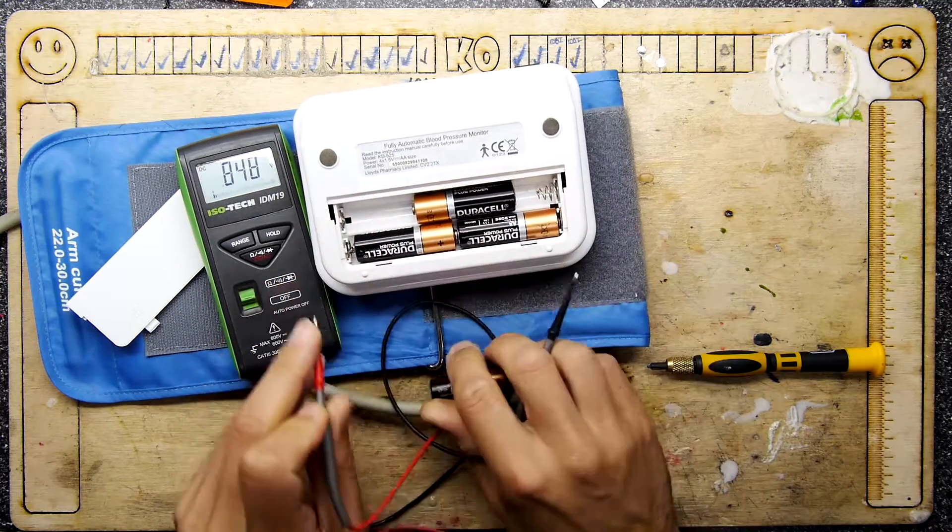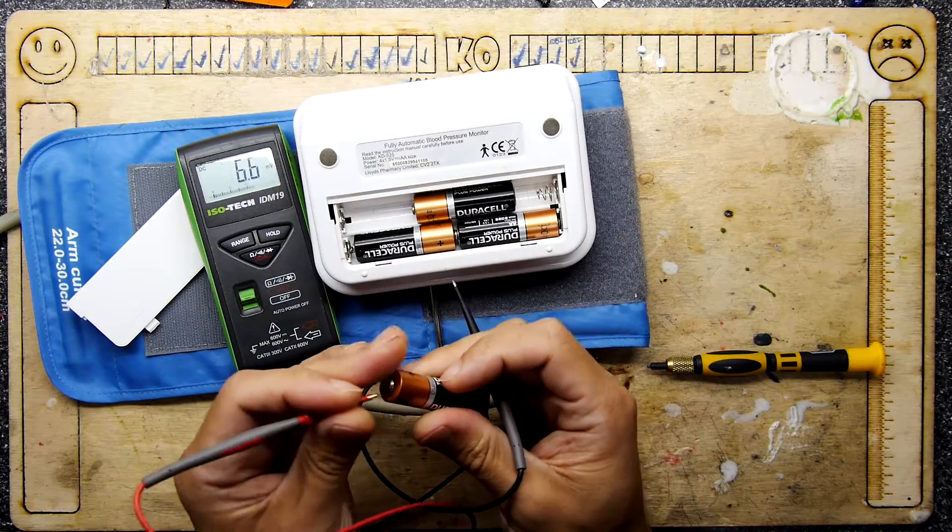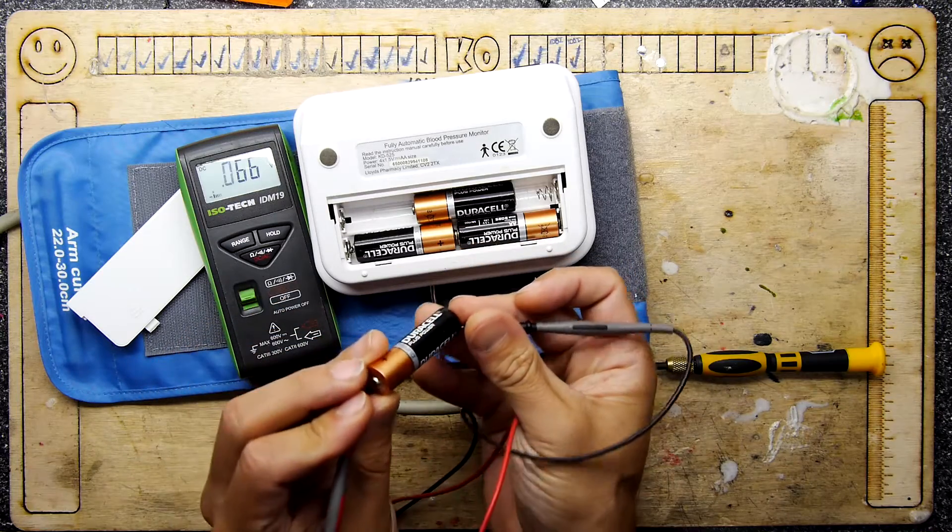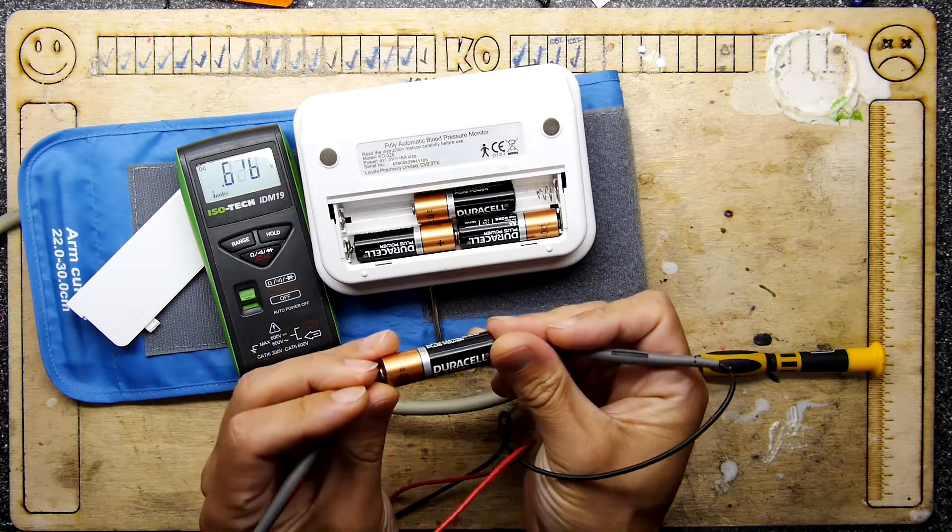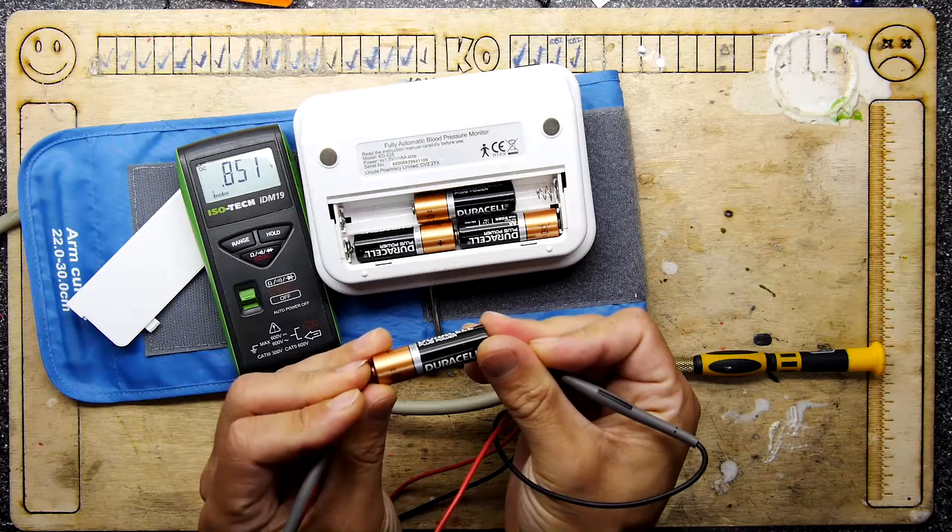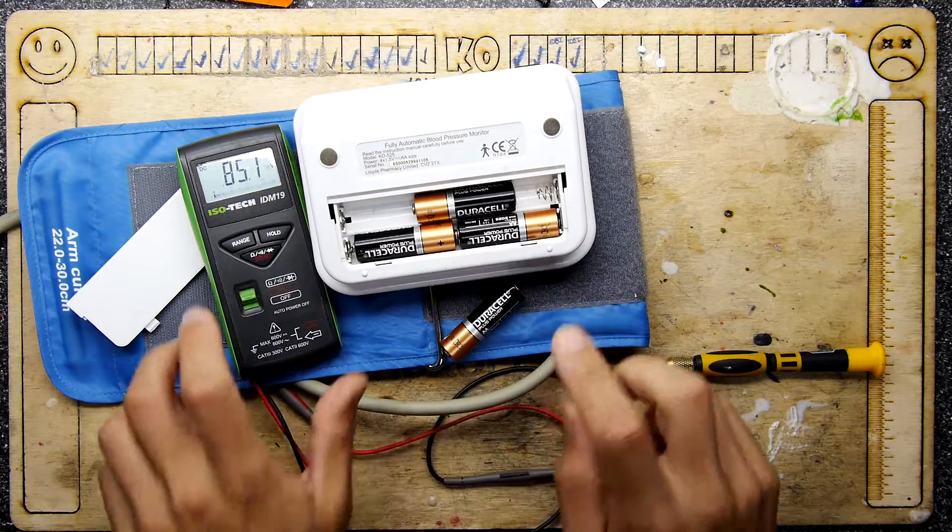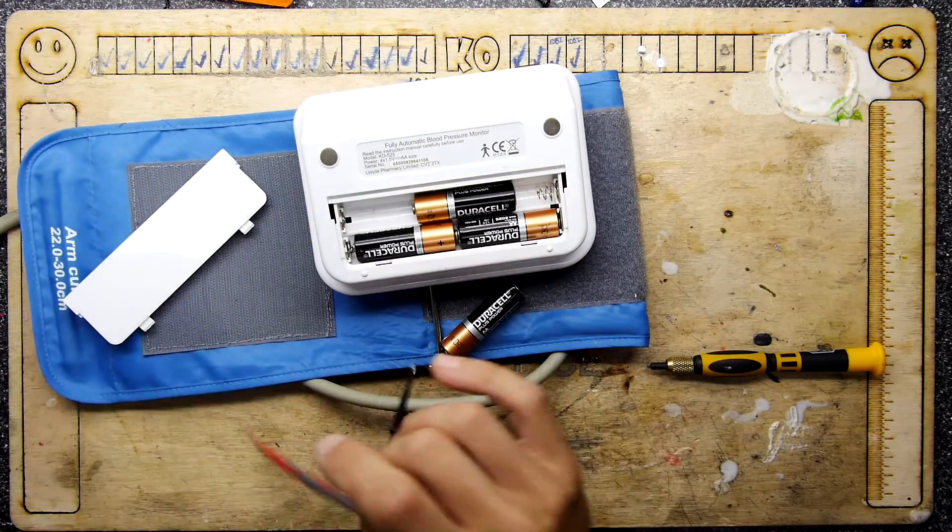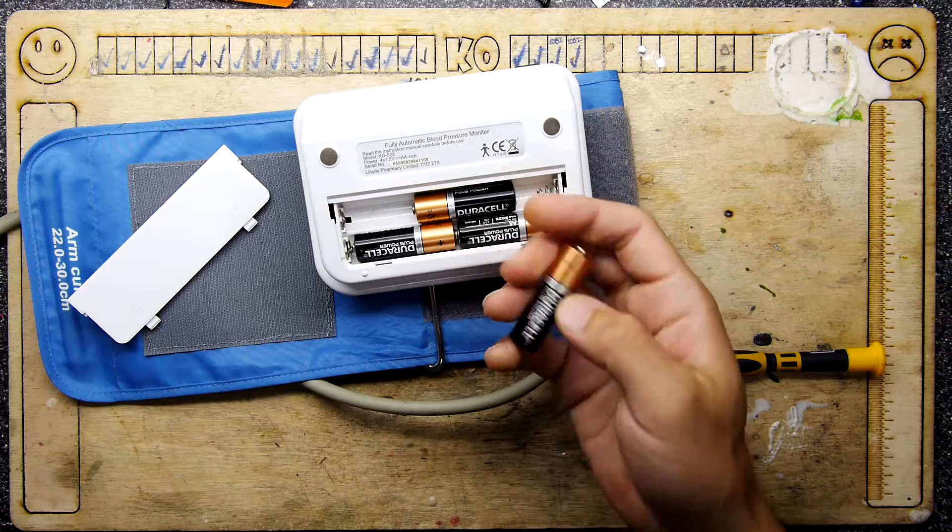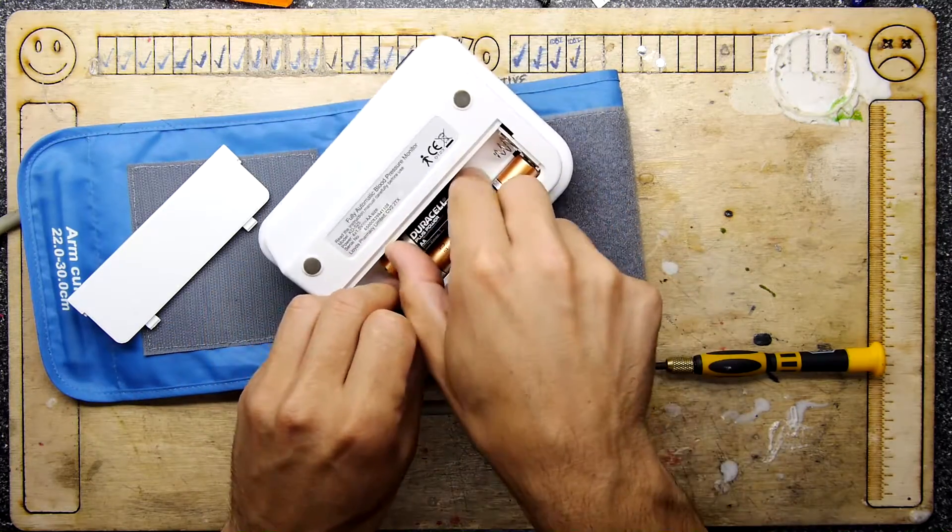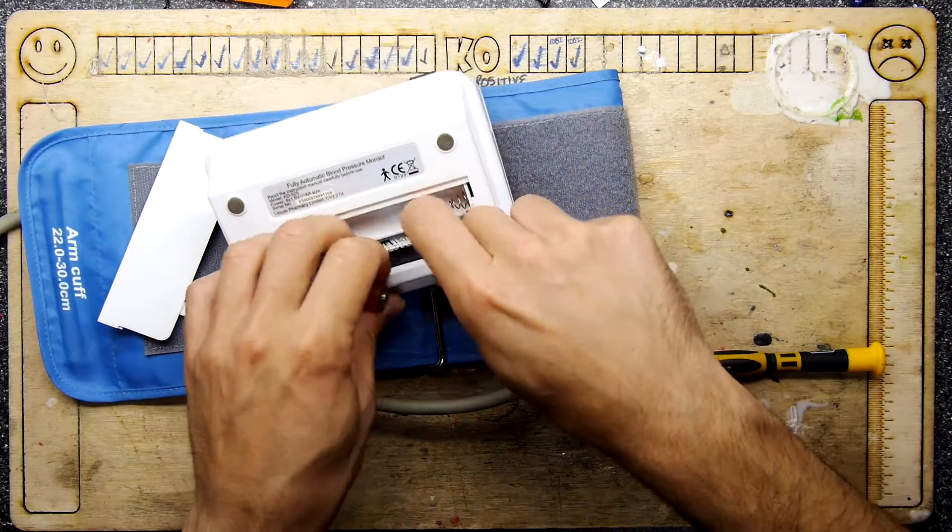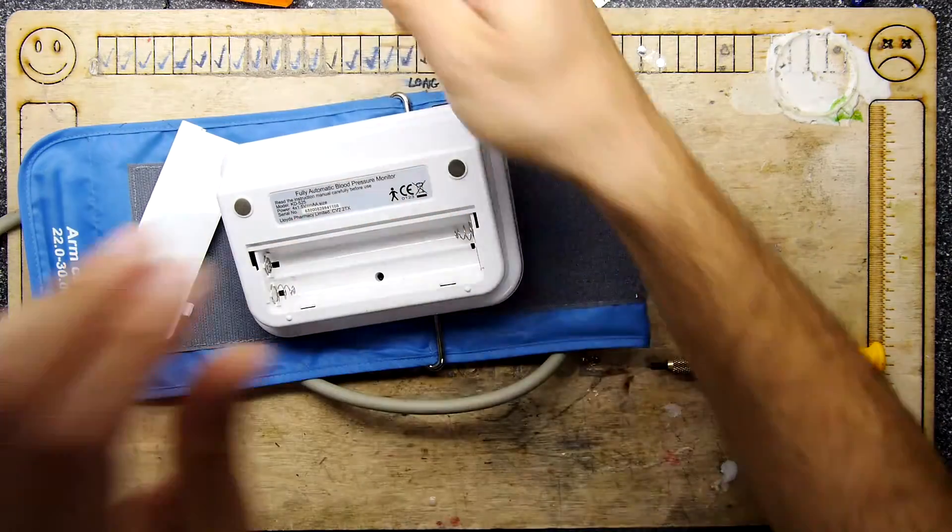The weird thing is I did have a quick go at this and it doesn't seem to want to work, certainly from the AC adapter input. These batteries don't look too healthy so we'll just start to swap them out briefly just in case.